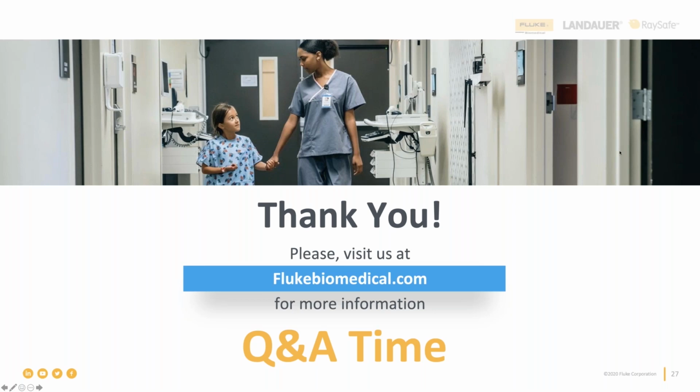So in your testing, you want to make sure that you're using the mandrel, so basically the thing that mimics the arm of the patient. You want to be using the right size there for the cuff that you're using. And like Katia said, the placement's important, but also the overlap of the Velcro strap can be important as well.